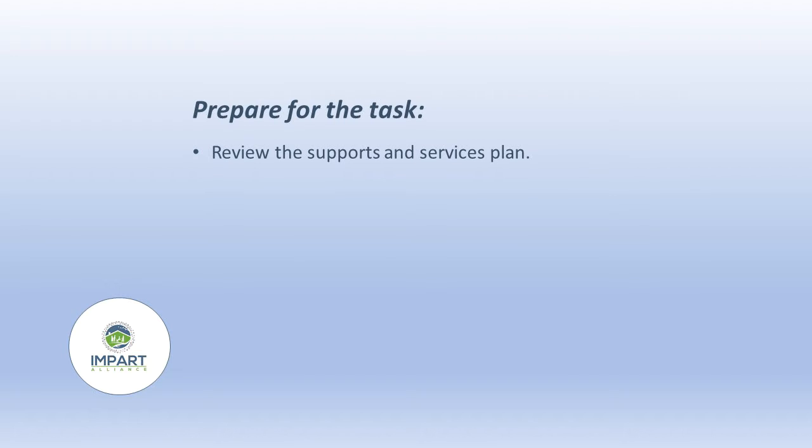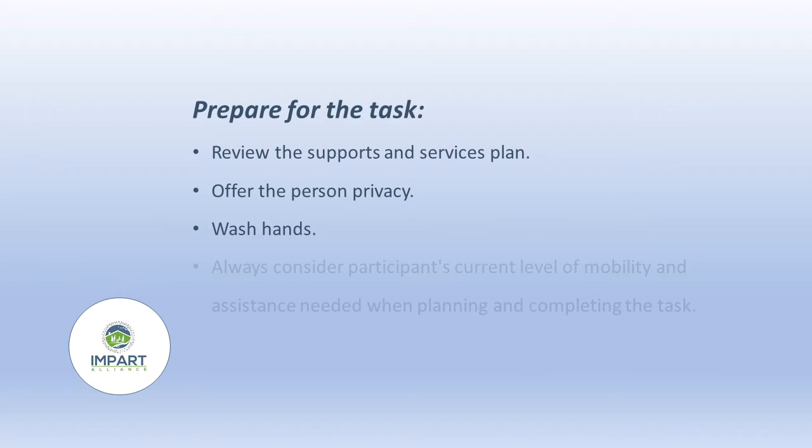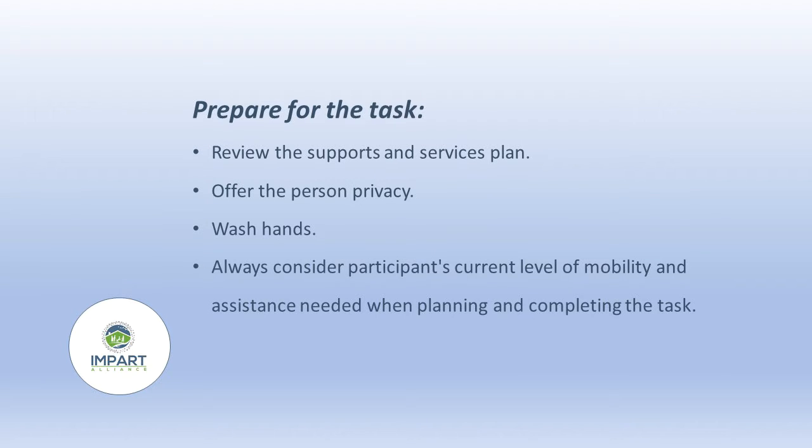To prepare for the task, review the supports and services plan. Offer the person privacy. Wash your hands. Always consider the person's current level of mobility and assistance needed when planning and completing the task. Ask if the person has any preferences about the task.